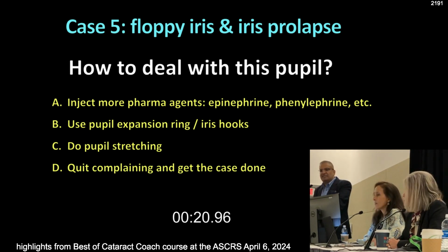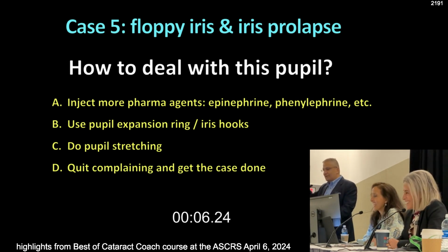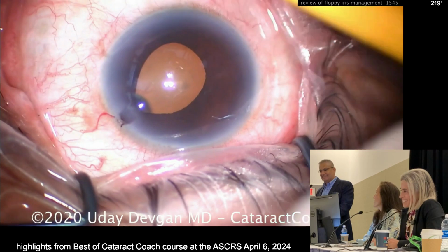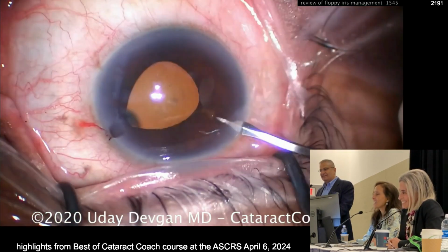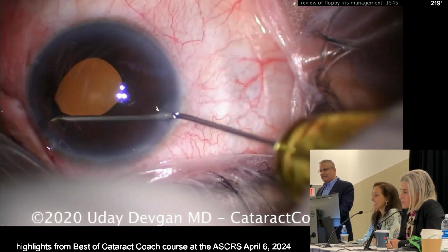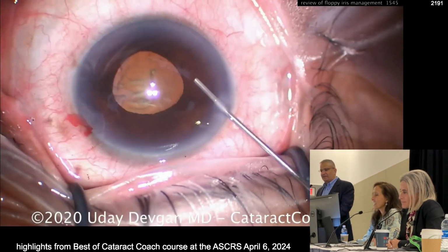So is that when you see that sign at the beginning, if it's iris prolapse through the para? You're immediately going to have trouble the whole case if you don't put something in and control that iris. So now you're thinking like, I'm going to do choice D, right? You are, I bet. No, I am a good student. I learn, I listen. I'm going to put in a pupil expansion ring because you taught me this last year. So here you go. An extra para. Because who told me? Extra para doesn't ever hurt, right? Yeah, extra para. Done. Get that back in the eye, pretend it didn't happen.